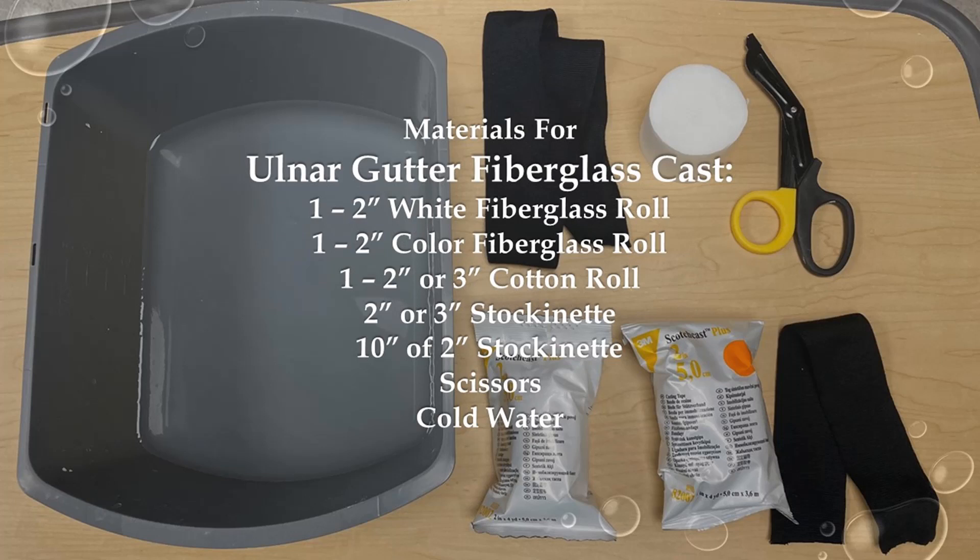To prepare for the ulnar gutter cast, size the two or three-inch stockinette from the MCP joints to two inches before the antecubital fossa, leaving about three inches extra on each end. Do not open the fiberglass until you are ready to apply it, because it will harden when exposed to air. Make sure you have cold water ready.